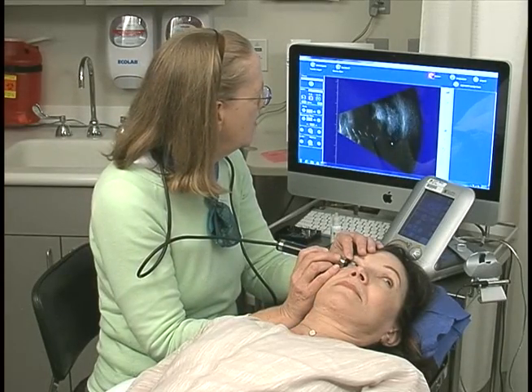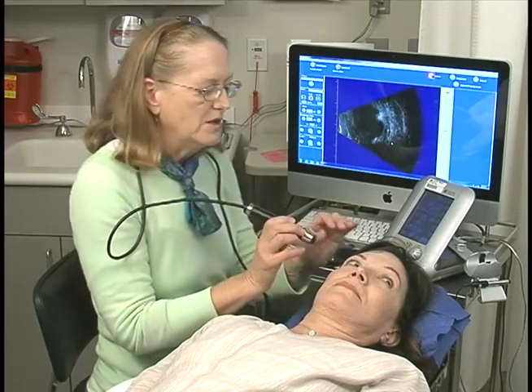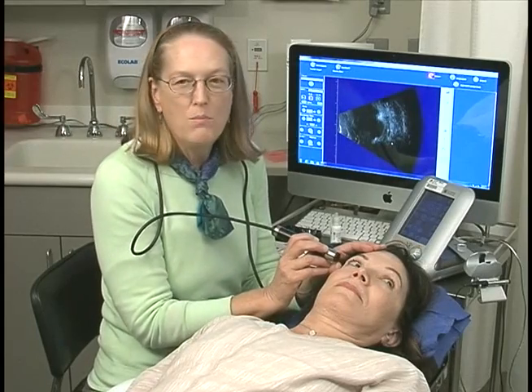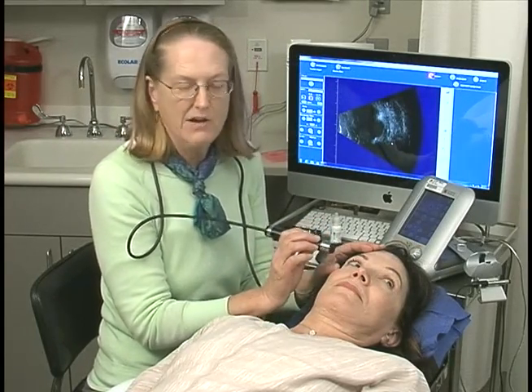In this case I get all the way out to her pupil — this is her iris and pupil — because I have no nose, no eyebrow, and no bones in the way. In this particular exam plane I can get very anterior. It will be a lot less in the next scan.